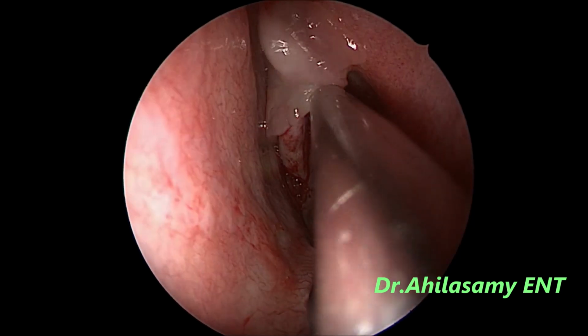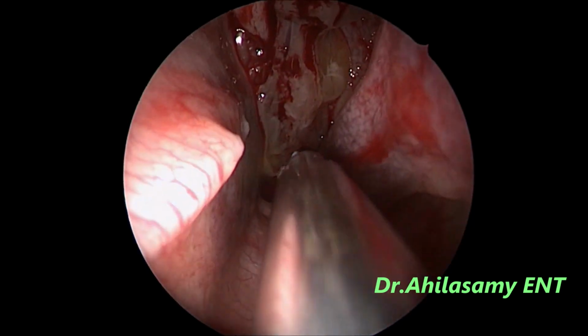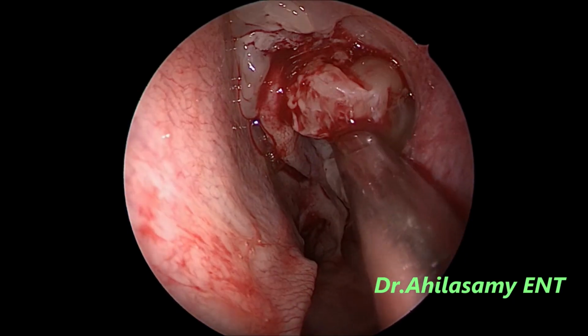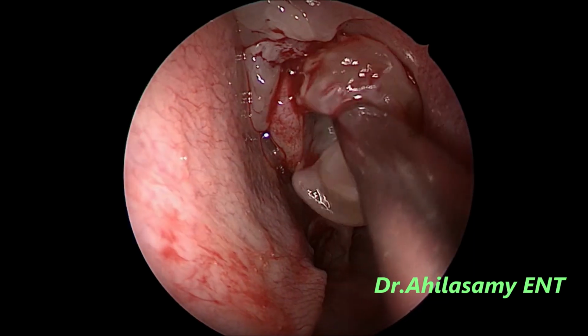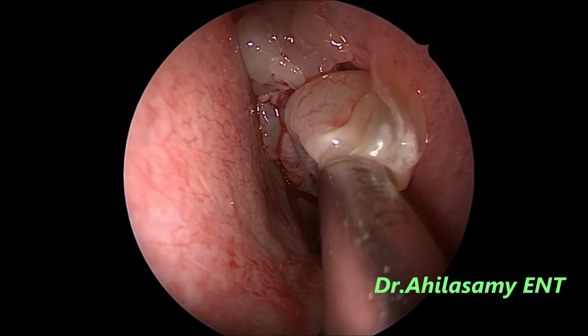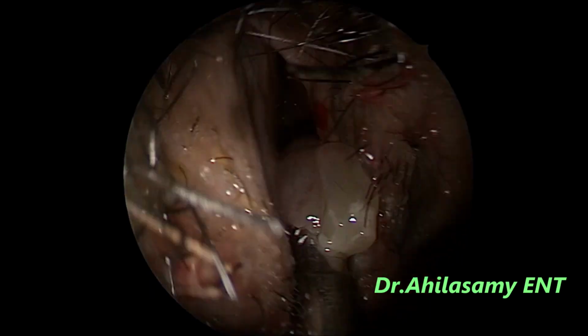You can appreciate the field quality, hardly any bleeding, in spite of the fact that we don't give any hypotensive anesthesia under local anesthesia. Hardly any bleeding. It looks almost like a cadaveric field. You can appreciate the field quality. More polyps for biopsy.